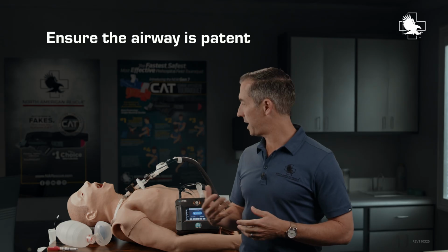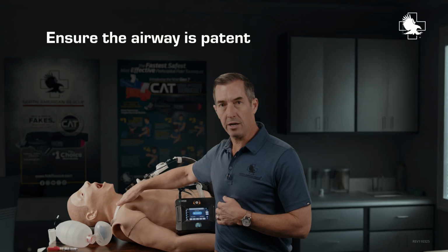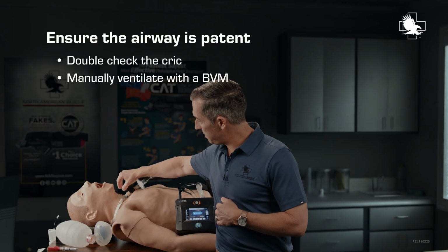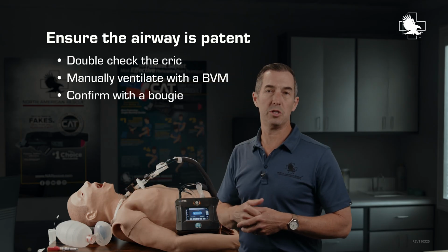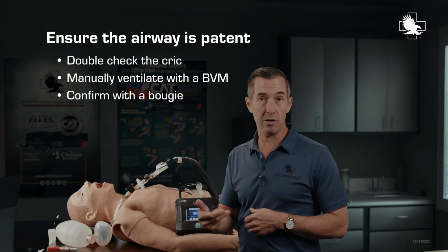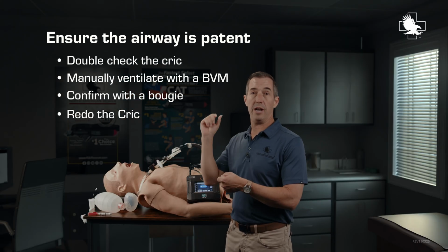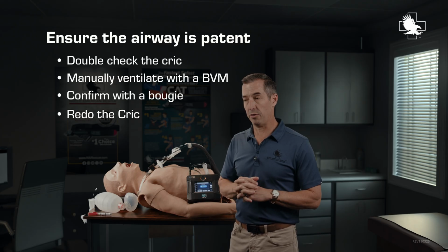If I'm ever in doubt if my airway is patent, what I can do is a few different things. One, on my crike, I can always take a look in here. I can manually ventilate using my BVM. And then if needed, I can confirm with a bougie as well. The other option is I can take that out and redo that crike. Get my bougie in, hopefully beforehand. I can remove that tube and then place a new one, confirm, and make sure I'm looking good, that I'm in the right spot.